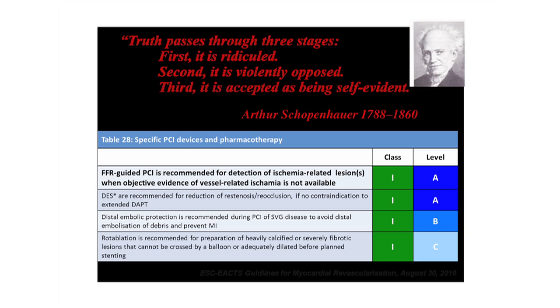It was a pleasure to give this presentation. And as my last slide, my concluding slide, I would like to show you this table, the guidelines from the European Society, which says that fractional flow reserve now is a class 1A level indication to be used in the cath lab.